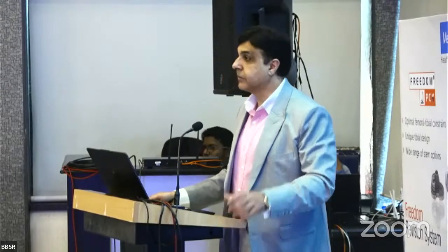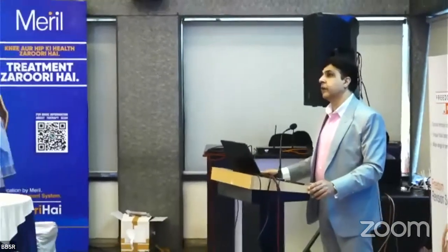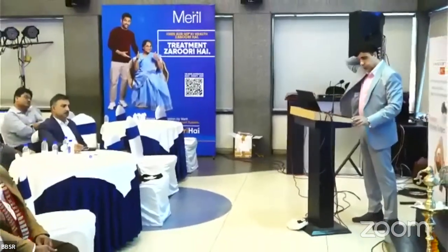Yes. Plus, in these cases, there are a lot of adhesions with the back of the tibia. So those positions are extremely important. Yeah, 7 years, 6 years. Other than this, that is CS1, I've seen patients with CS1 having infection of their implants. So some part of infection. Yeah, they were. So what Dr. Deva is trying to say is any remote site of infection which can be a source. We worked that up, and it was not there, but as it turned out, we will move past.